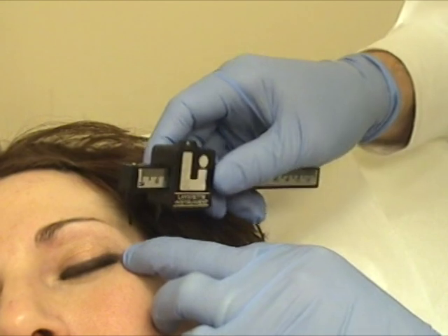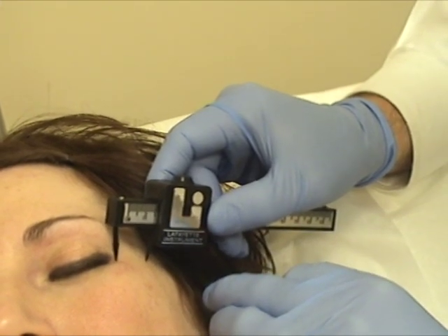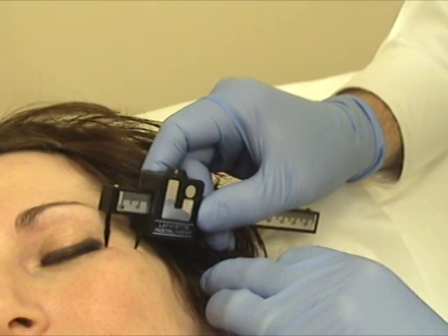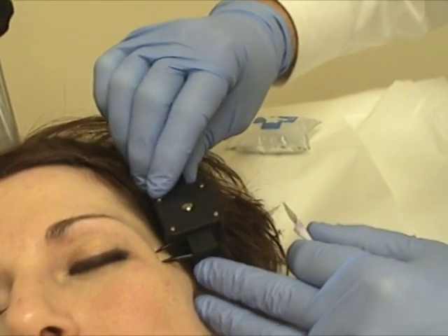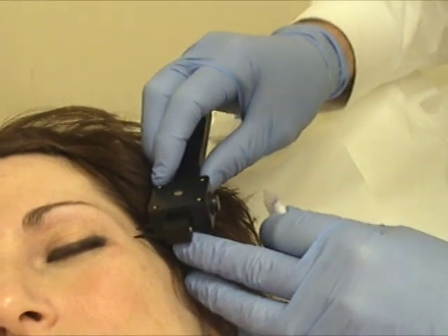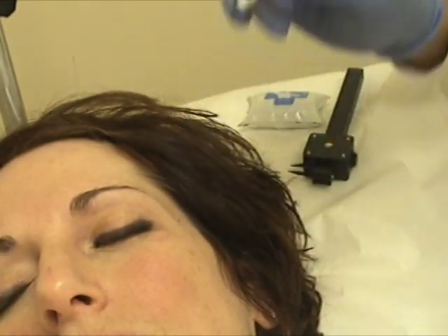The landmarks here: the lateral orbital rim — we go 1.7 centimeters directly posterior, and then we're going to go 0.6 up. That should be the location of the nerve, and I'm going to mark that.